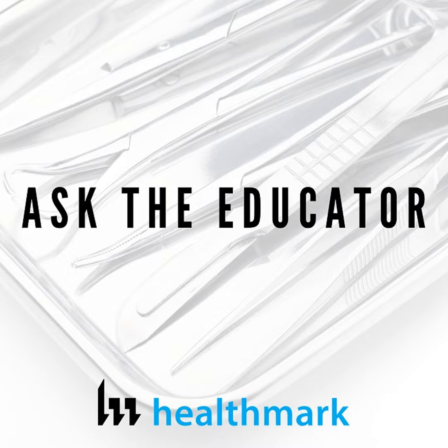to the point where even the manufacturers' IFUs are acknowledging it, because there have been so many MDR reports. The FDA MAUDE database has a lot of issues with shavers. So now the manufacturers are saying we need to use some type of optical inspection inside. And how else do you do that but with a borescope? I think that's a great justification. If anybody out there needs a borescope, some of these IFUs actually specify to look inside of the shaver to make sure it's clean. Yeah, that's a great point.